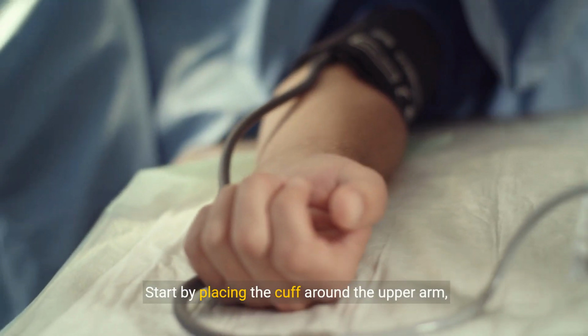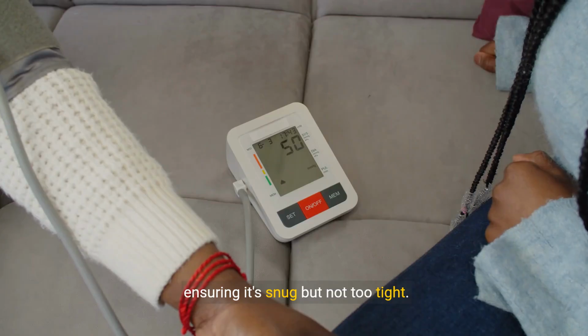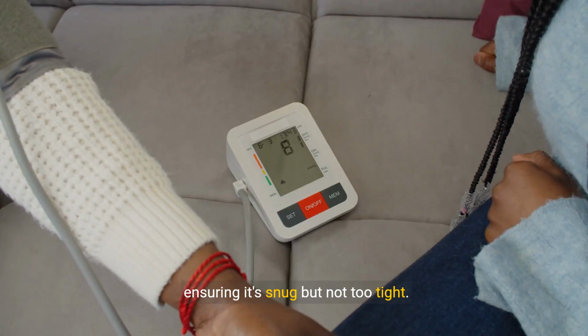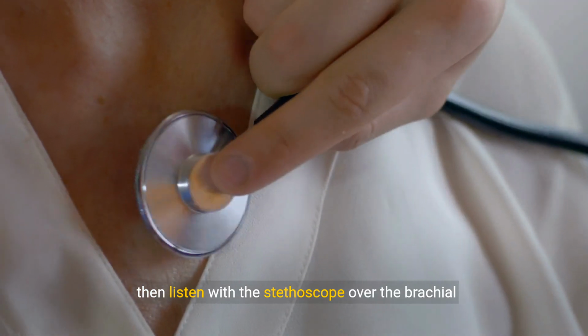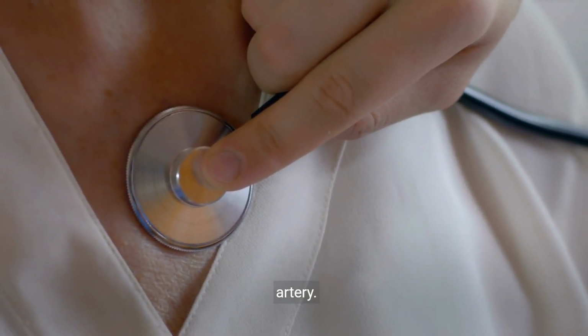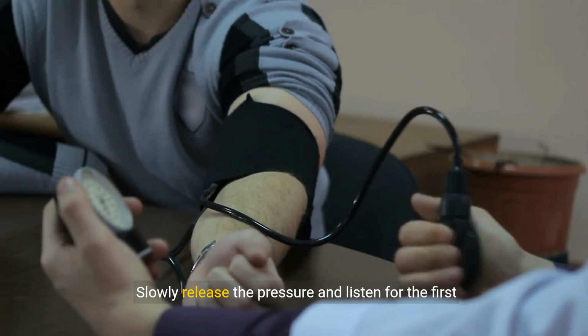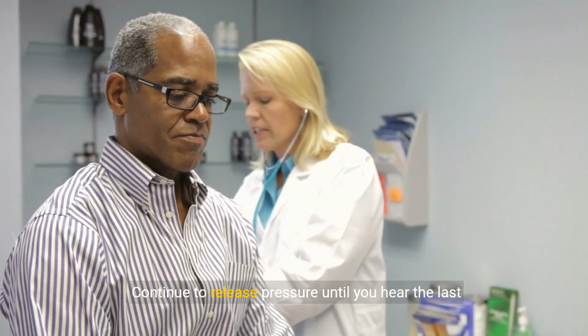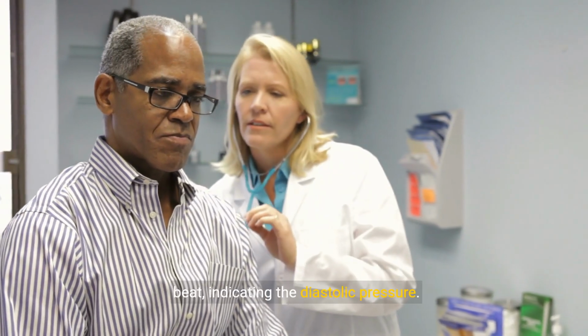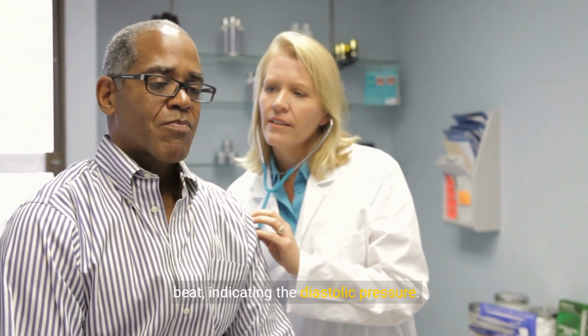Start by placing the cuff around the upper arm, ensuring it's snug but not too tight. Inflate the cuff until it tightens around the arm, then listen with the stethoscope over the brachial artery. Slowly release the pressure and listen for the first beat. This is the systolic pressure. Continue to release pressure until you hear the last beat, indicating the diastolic pressure.